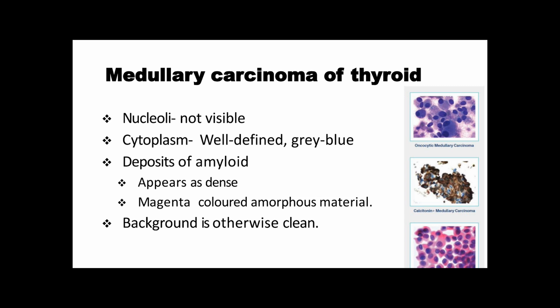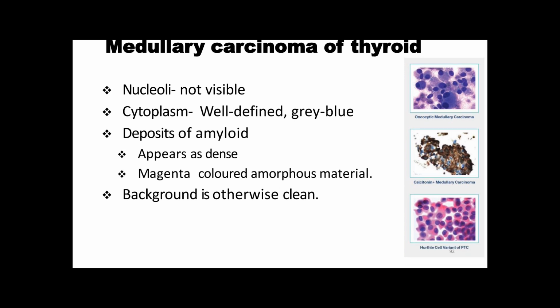Here you can see the pictures. When we consider the background, the dark background is otherwise clear, right? Normally clear.